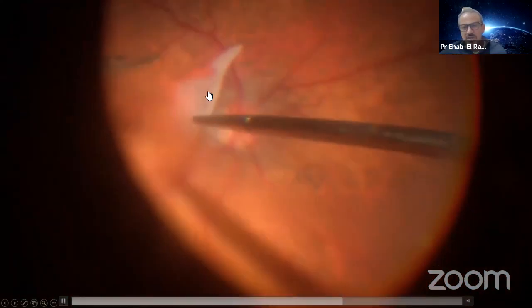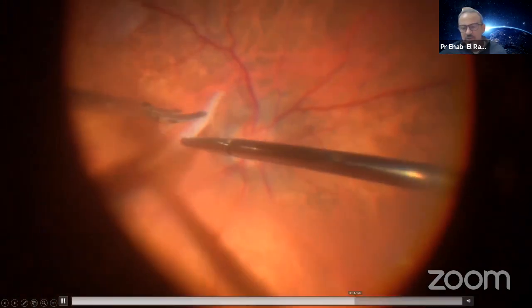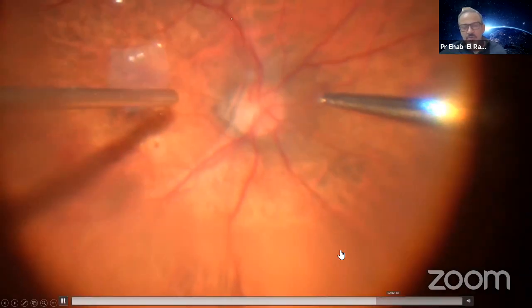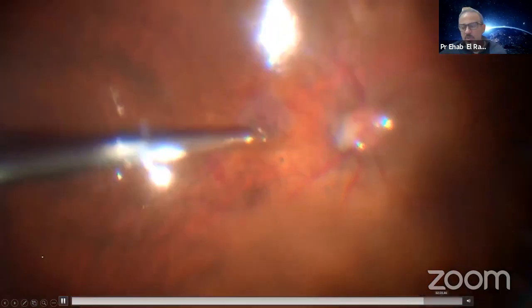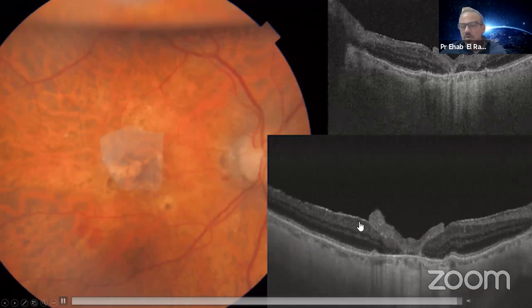So I decided to cut it again, trim it to a smaller size, and put the sticky part over the retinal surface like a stamp over the macular hole there. Perfluorocarbon, make sure it's stable in place. Then I removed the perfluorocarbon and went to gas and air. This time it's stuck in place, but again, putting it over, I feel that this is a bulky piece of tissue interfering with the normal photoreceptor realignment. So sometimes putting patches over the eye interfere, and you can see this is as early as the first week. It is really a big patch inside the eye.